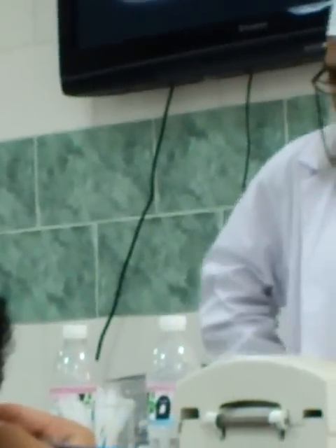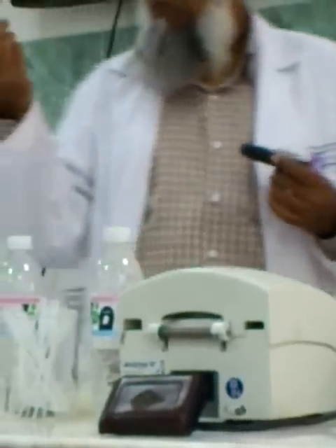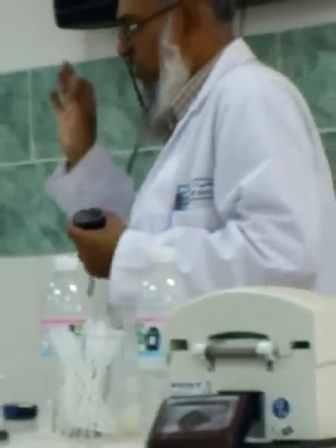For that purpose, an arrow is given. This is called an arrow. So in the direction of the arrow, you have to introduce it into the glucometer. Otherwise, if you introduce it in the wrong direction, it will not work. So for proper working, the correct direction of the glucose strip is required. Okay?